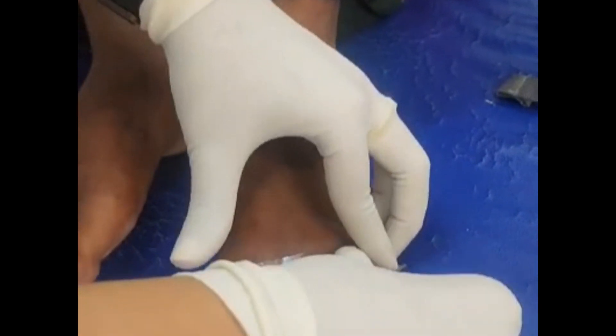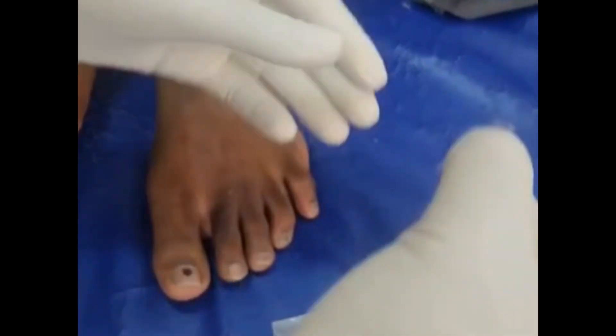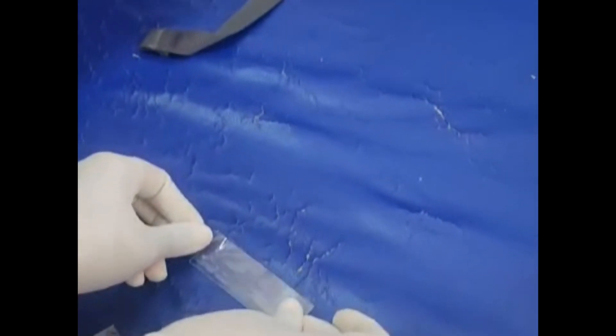The next is the adhesive tape test. Here we apply a simple cellophane tape to the suspicious site. It is pulled off and immediately transferred onto a transparent slide and visualized under a microscope.